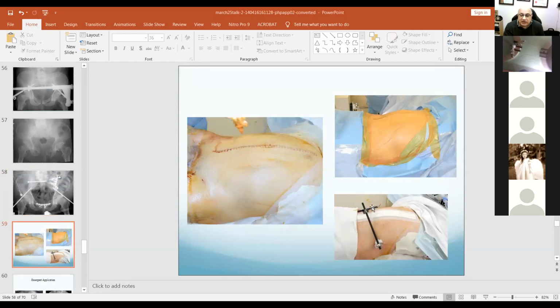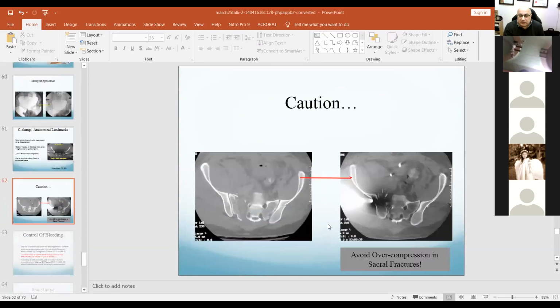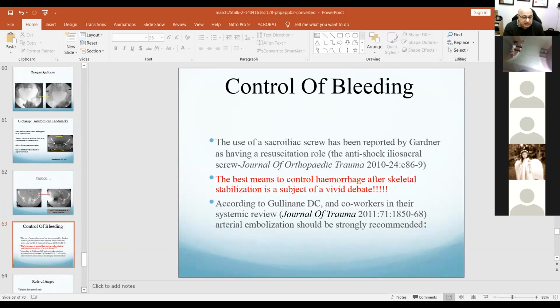So this is called a delta configuration. If you can see it, you put one pin on each side, and then you bring it together to hold together, and it brings a lot more stability. If you want to make it even more stable, you can put a rod all across it also. Okay, so let's go somewhere else.